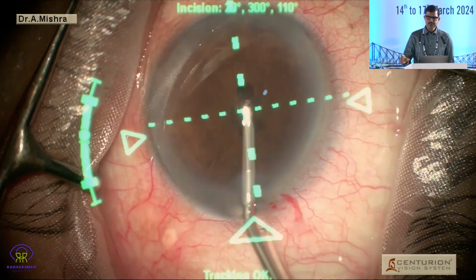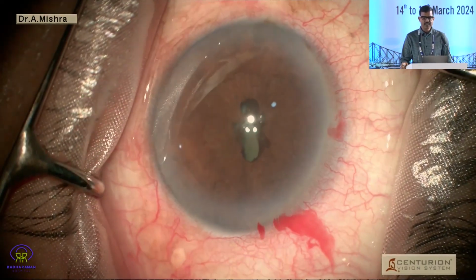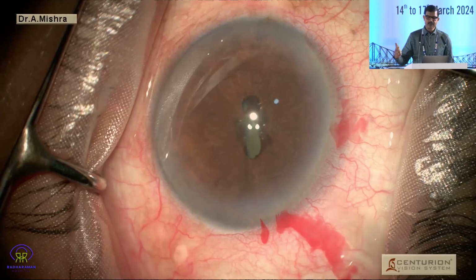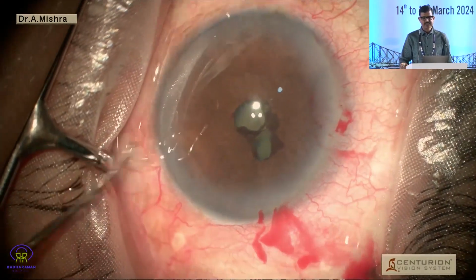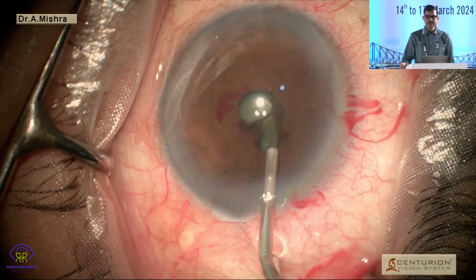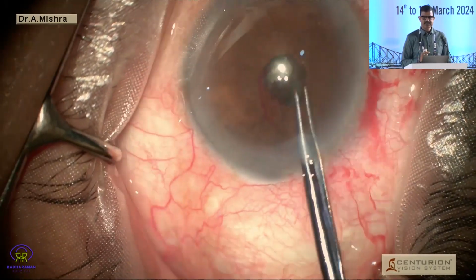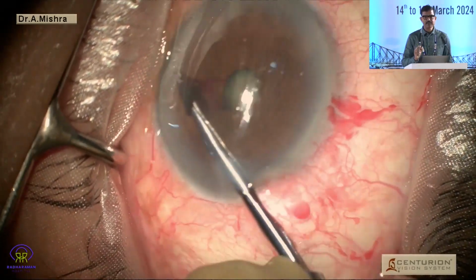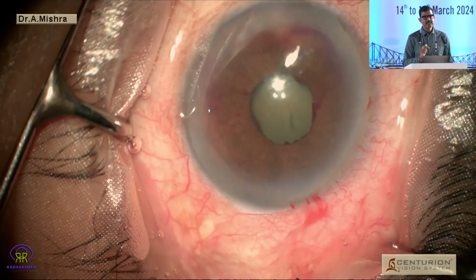This is a patient who has got a long-standing history of uveitis. As you can see, the pupil's not even visible, and the cyclitic membrane is there all around. So a hole needs to be punched first, and then with the Simcoe, it was extended. The moment the cyclitic membrane is peeled off successfully, you will have a little bit of bleeding from the pupillary margin. That, in fact, is an indicator that shows you that the pupillary membrane has been effectively removed.